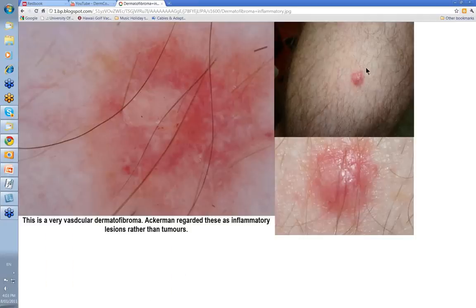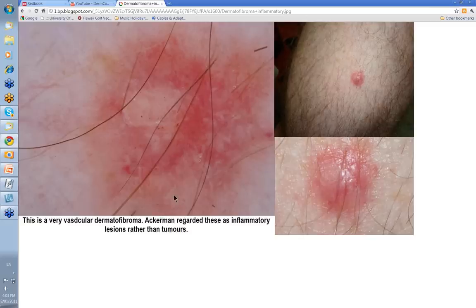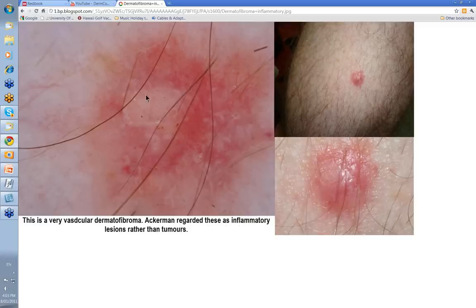Then there's this one — virtually all pink, with just the slightest haze of brown round about. You might well think that's an amelanotic melanoma, but this is a very vascular dermatofibroma. As Ackermann regarded these as inflammatory lesions rather than tumors, what we see at the end is the result of the ongoing inflammation. Again, you've got this white structureless area here, very little in the way of pigment round about, and the rest of it is vascular — so this would be a slightly difficult one to diagnose dermatoscopically.